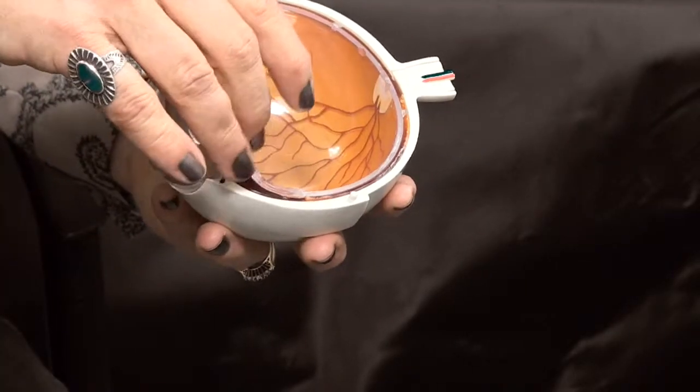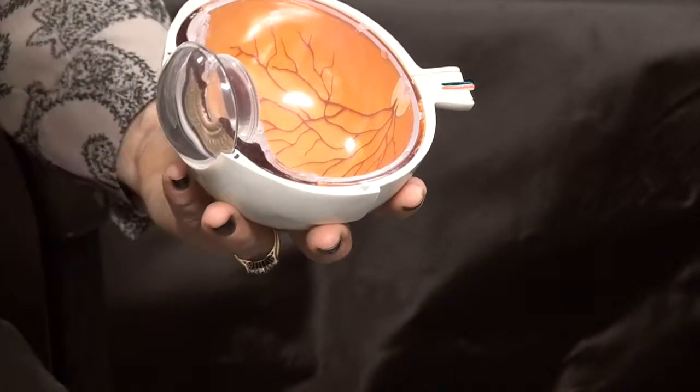And then we put the lens inside your eye that we're replacing this one with, and a shield on your eye, and you go home. Okay, that's your typical traditional cataract surgery. Uses a blade and puts in a lens that will help you see distance. Pretty straightforward. And then some people can elect to get a customized lens to help with reading and so on?